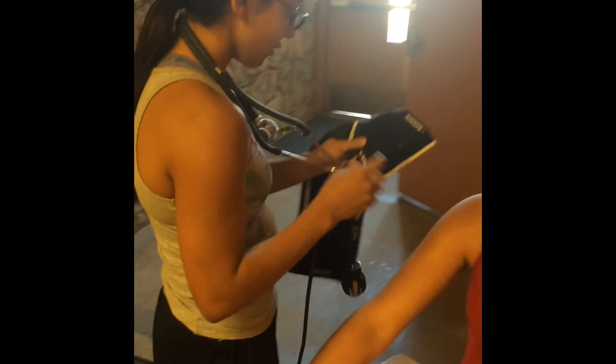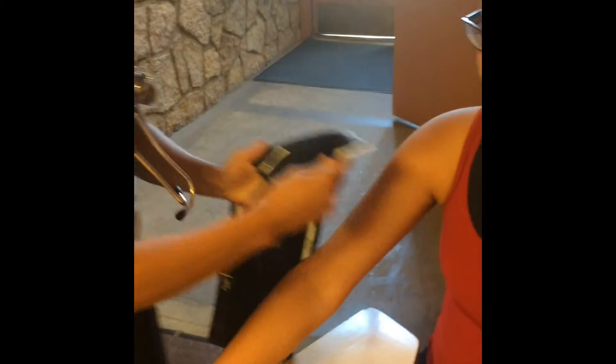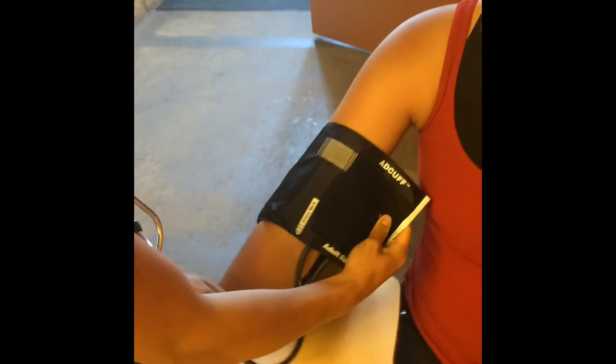In order to measure the blood pressure, we will be needing a sphygmomanometer, which consists of a pump and a cuff. Begin by wrapping the cuff firmly around the upper arm at heart level.